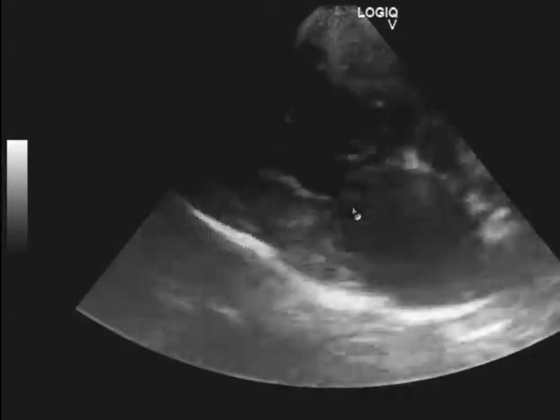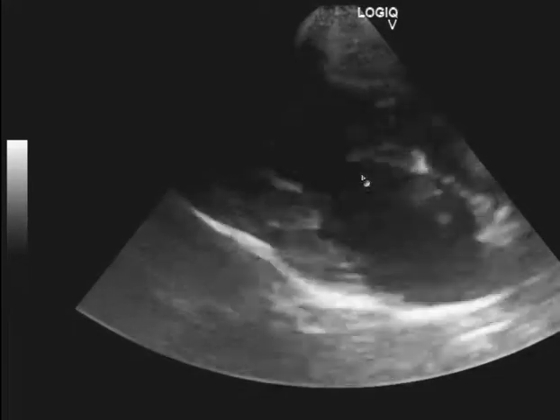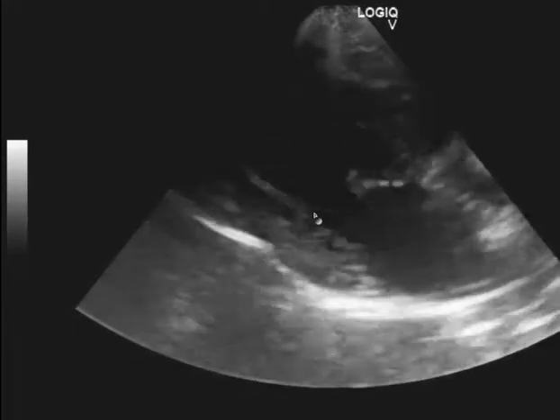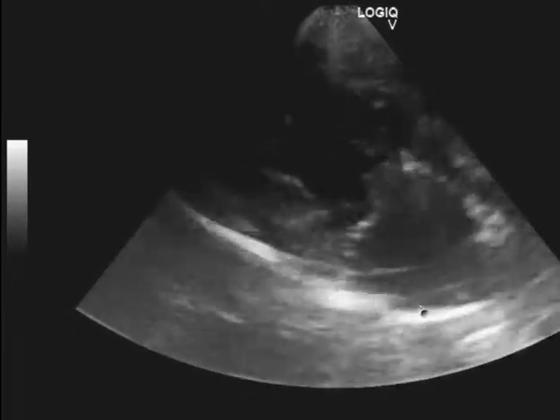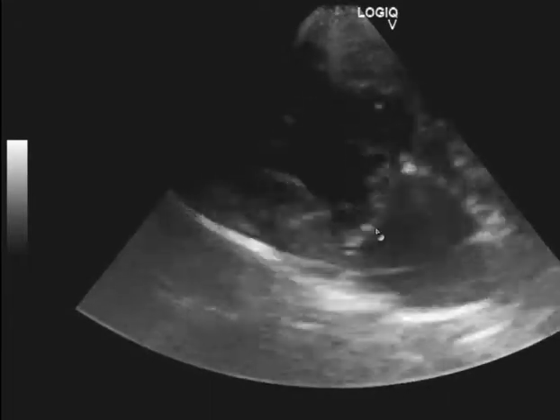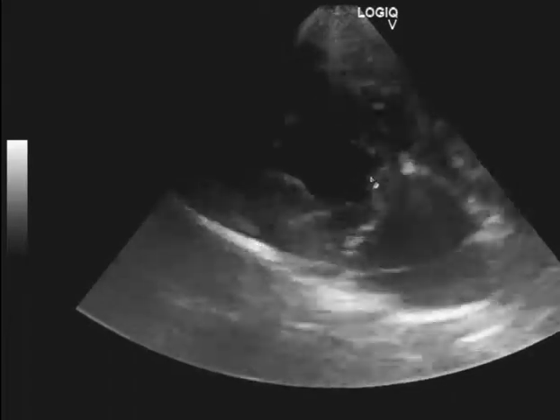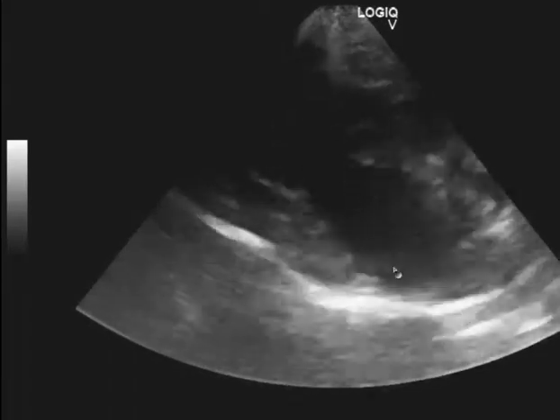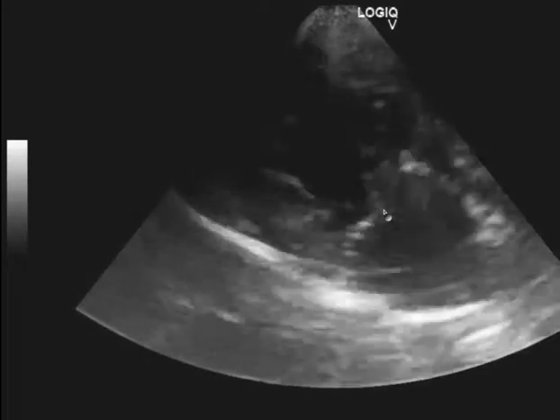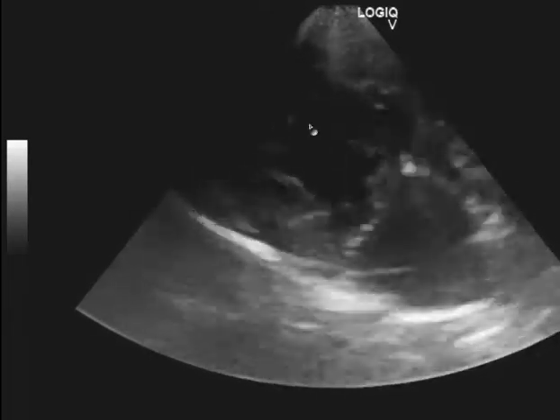This is a good spot for mitral valve interrogation. Put your color flow one-third cranial to the left of the mitral valve annulus and two-thirds into the left atrium — your jets are about 80 percent of the time going to come in this direction. So you want to line up your color flow, then spectral Doppler — PW first and then CW on the mitral valve — every time in this direction once you see color flow come in.